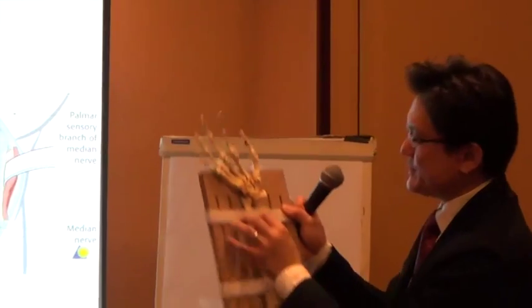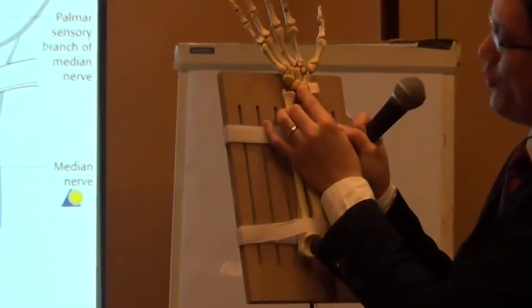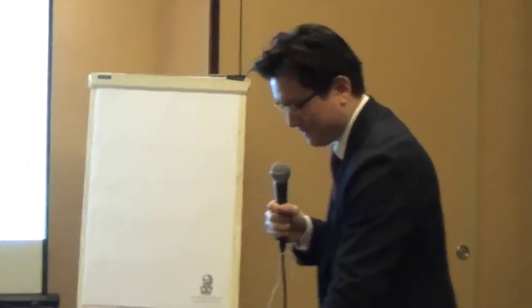Once I reach this stage, I will use a bone clamp and I will actually open up the fracture site and release the soft tissue that's holding the dorsal side of the distal fragment so that you can reduce the distal fragment back up to the normal height. If you don't do that, you can pull and pull and pull, it will not reduce, okay? So that's also a very important key step.